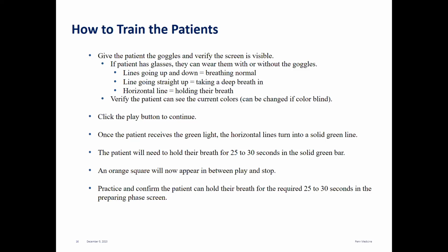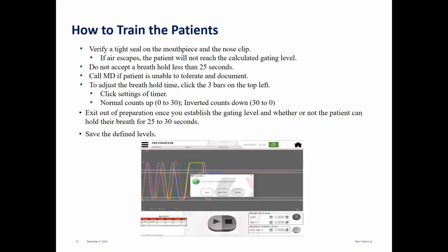You kind of just want to base it off of their comfort level at first. But then if they can hold to that 30, you're going to let them breathe normal, talk to them, see how they feel about the 30 seconds. You are able to drop them down to 25 seconds if they feel like 30 seconds is too much. Sometimes patients get a little overwhelmed and they feel that 30 seconds is too much, even though they were able to do it. I try to encourage them that once they are using the system more, they actually get better at it and it does get easier for them.